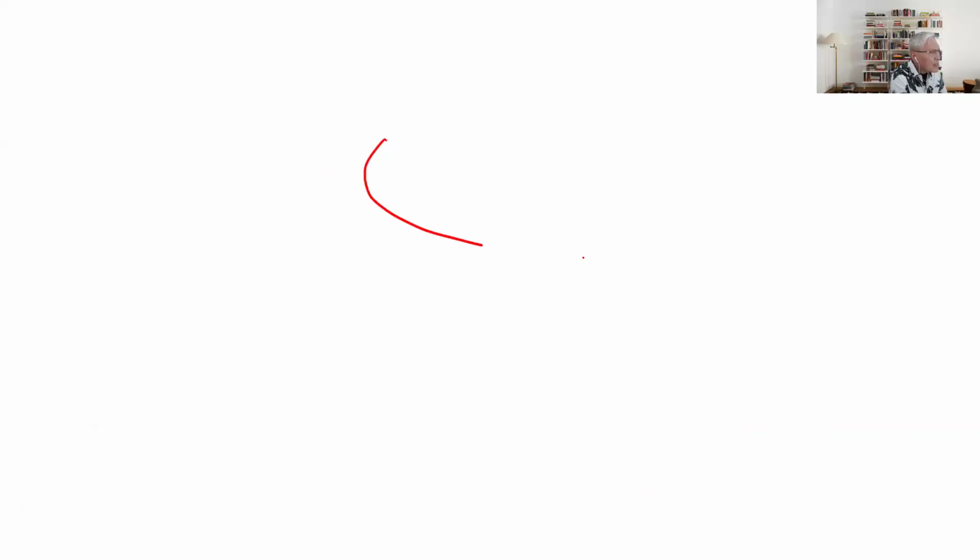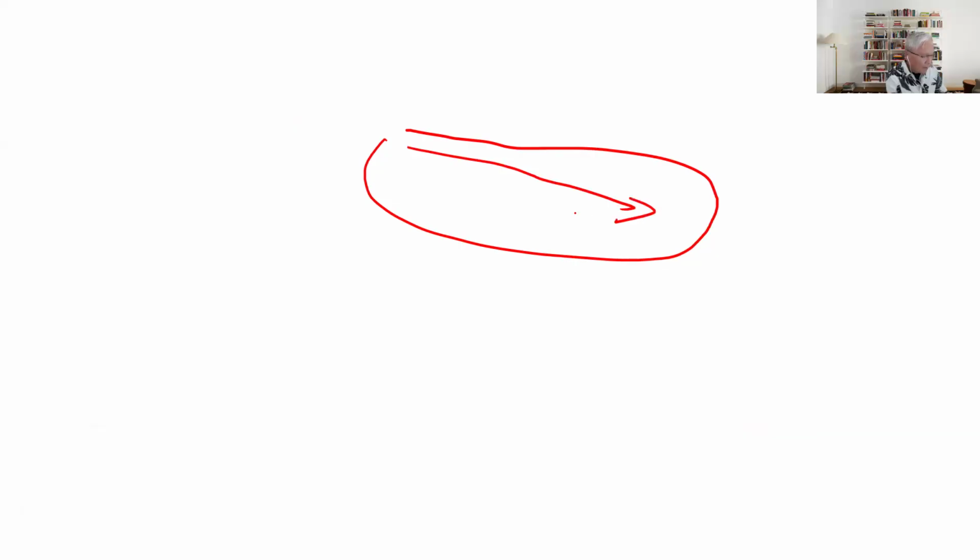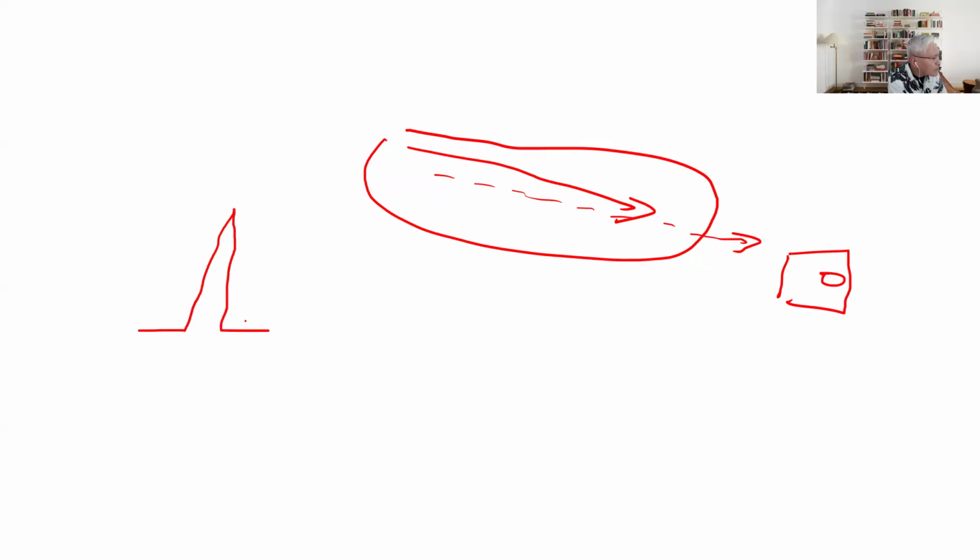So let's say that this was the heart, and usually the movement of the heart is from right to left. Your heart is from an orientation going towards the left side of your chest. So if I have a camera over here, this is my camera, and the movement of electrical current is going towards the camera, this explains why your waveforms sometimes are going to be upright. Similar to, let's say that you're taking a picture of your friend, and your friend is going to come towards you.